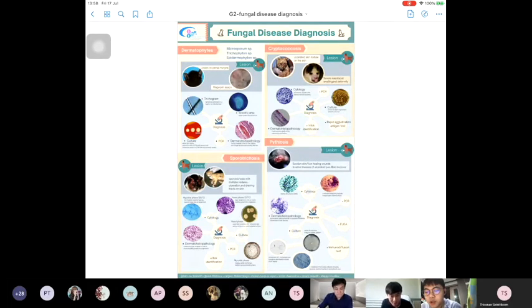My name is Kongpop Patapidusita from Group T. I have a question. If there is co-infection of several fungi, which method of diagnosis do you think is the best to differentiate species of the infection? Yes, I can see the diagnostic method, VITEK, identifies many organisms. So at first, I think VITEK is the best.